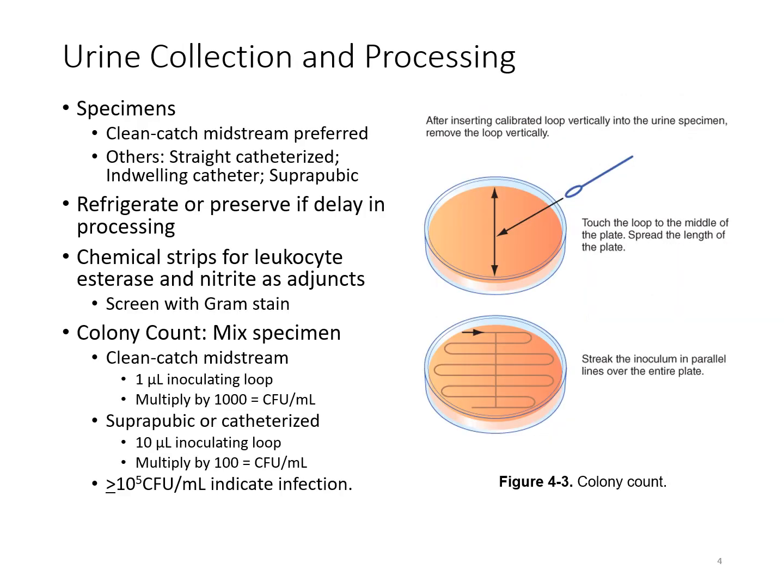Urine specimens that are submitted are generally just going to be a clean catch midstream urine, but occasionally you may get specimens through a straight in-out catheterization, some sort of indwelling, more permanent catheter, or a suprapubic aspiration, where they go straight through the skin into the bladder to aspirate the urine sample directly from the bladder.